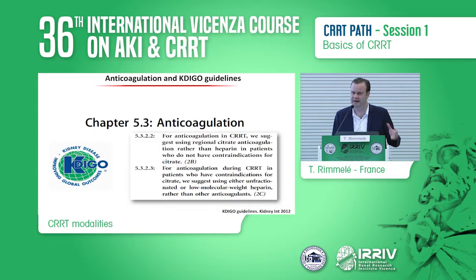That's why the KDIGO guidelines, again, the international recommendations, tell us to use citrate as the first line of anticoagulation in our patients. In all patients, in the patients with bleeding risk, of course, you don't want to use heparin in these patients, but also in patients with no bleeding risks, as long as you don't have any citrate contraindication.